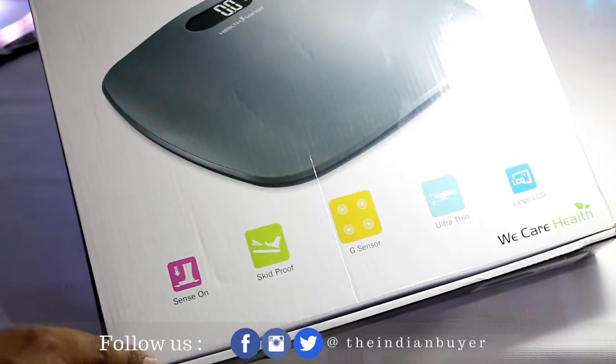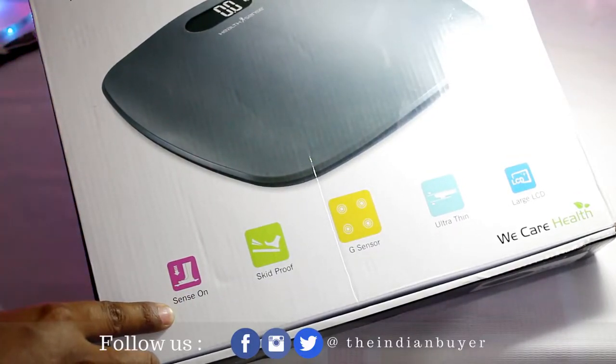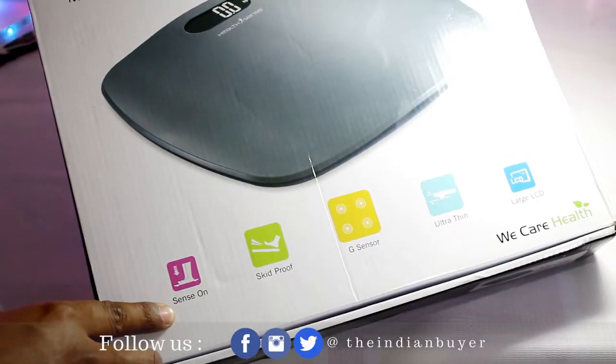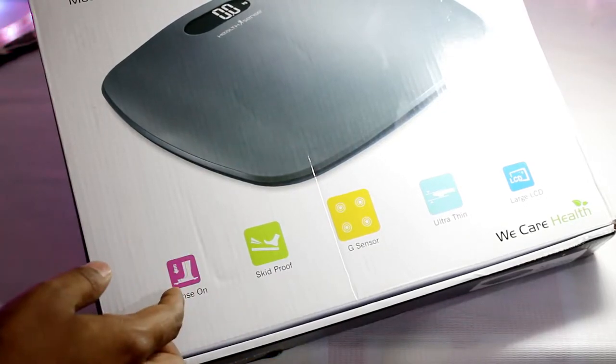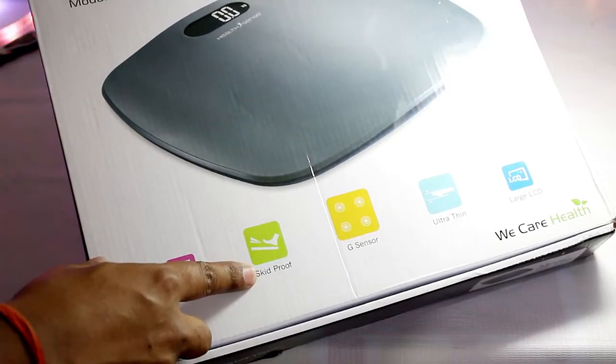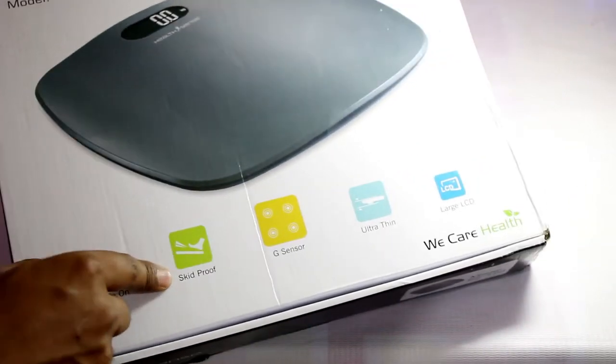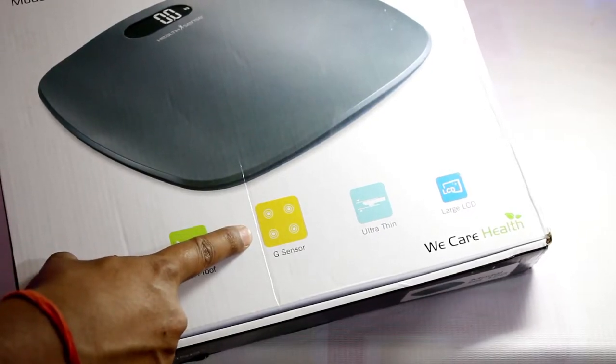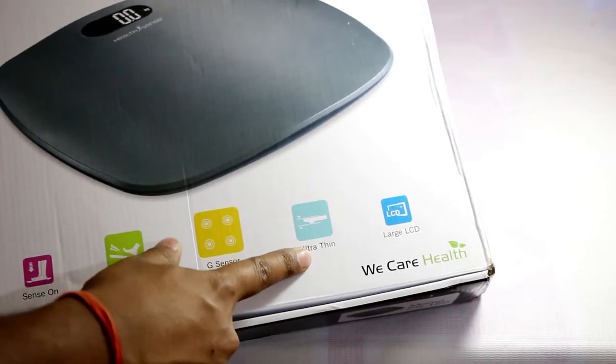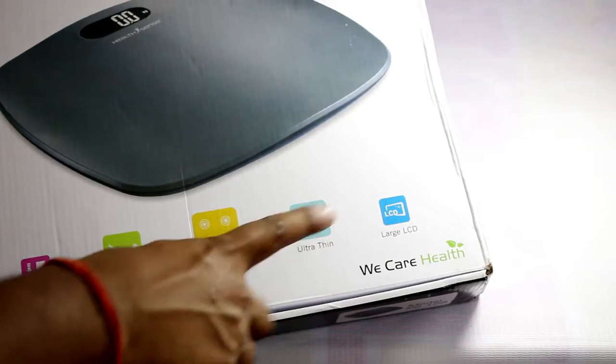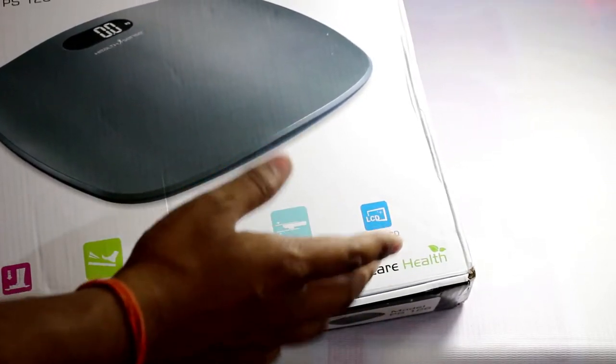On the bottom side you will find all the features displayed here. Like it has automatic sense-on feature, it has also got rubberized feet so it's skid-proof on smooth surfaces, then it has G sensor at four corners. All of these, yet it is very ultra light and thin, so it's very much portable as well. Finally, it has a large backlit display.